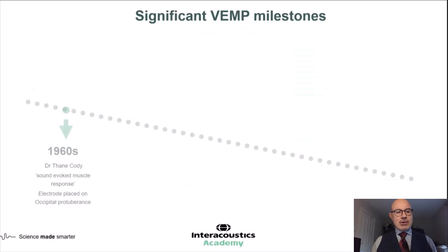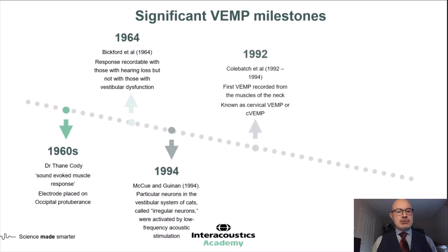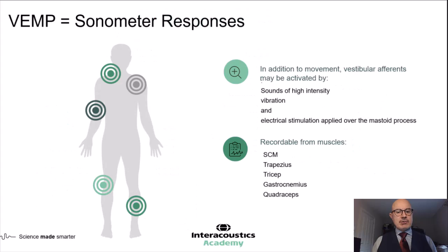It's really at that turning point that looking at sound-evoked muscular responses started to gather momentum in the research. Today is an introduction, so we're not deep diving into any of this research, but it's useful to have in mind where these assessments come from. As technology evolves in the latter part of the 20th century, we get to where we are now, recording these with evoked potential auditory detecting systems, with specific stimuli we can use to elicit the responses and protocols to maximize the potential of recording reliable results.